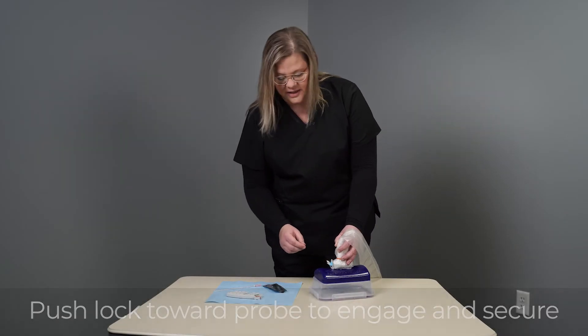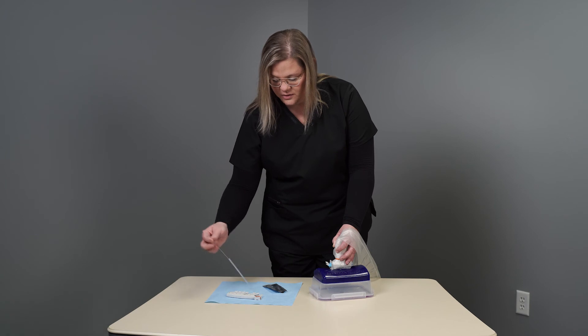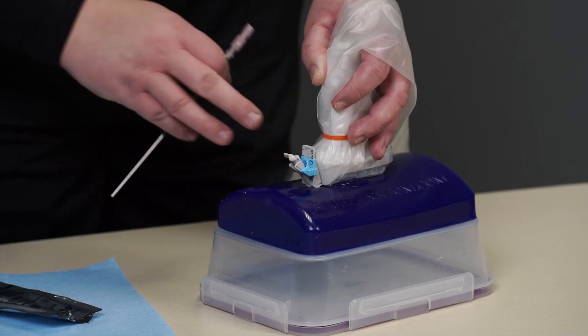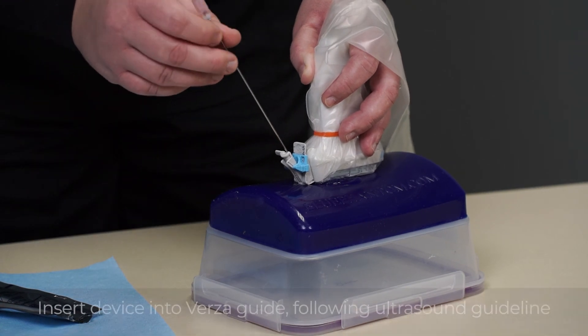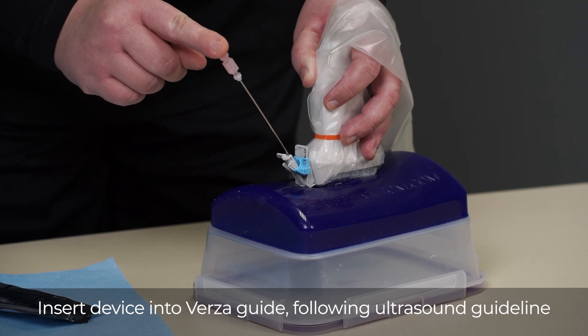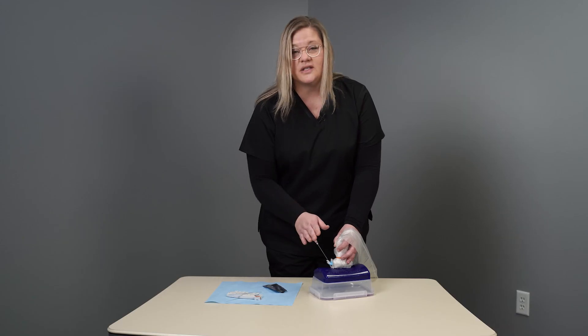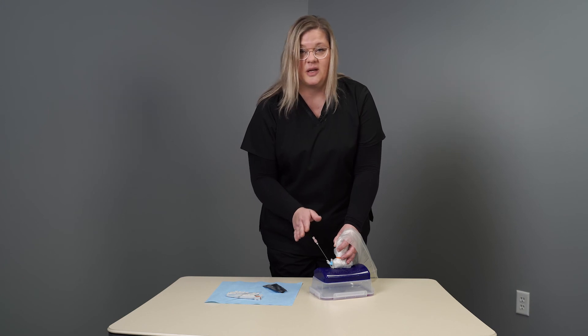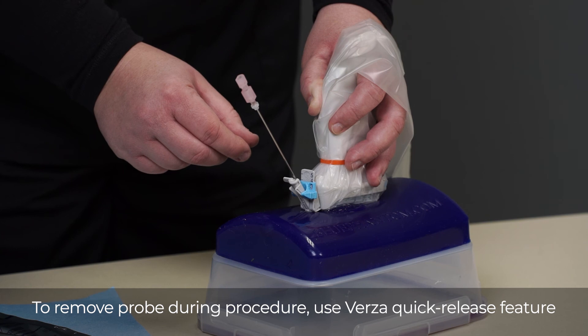Once you've slid the lock in and you're ready to do your procedure, take your device, making sure that you're flush with the patient, and insert the device following the biopsy line. Once you've inserted your device in the patient, there may be a need for probe removal — the Versa comes equipped with a quick release feature.